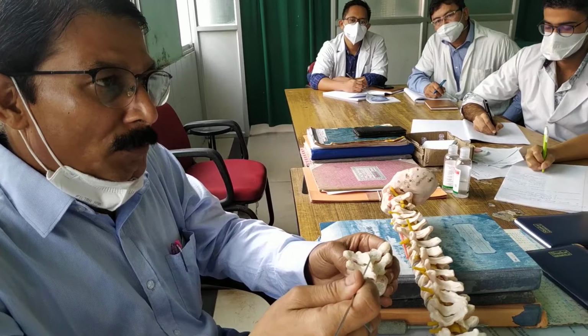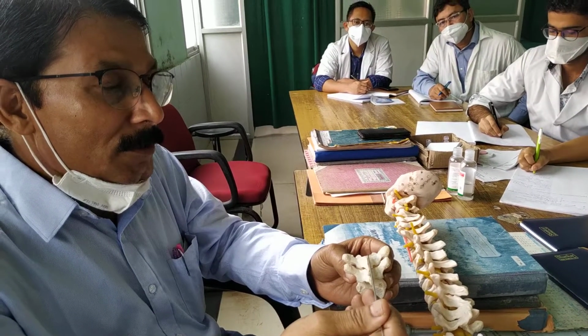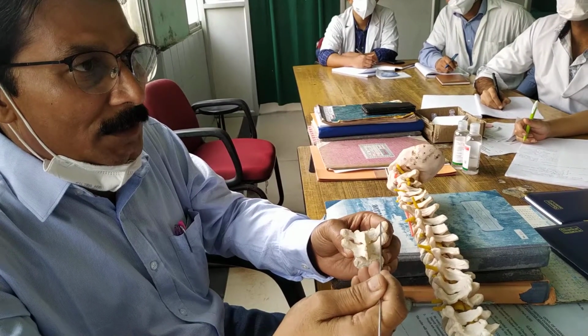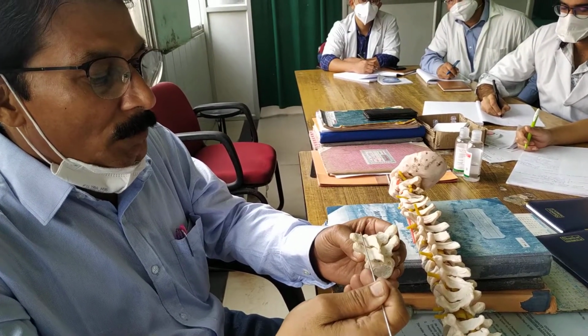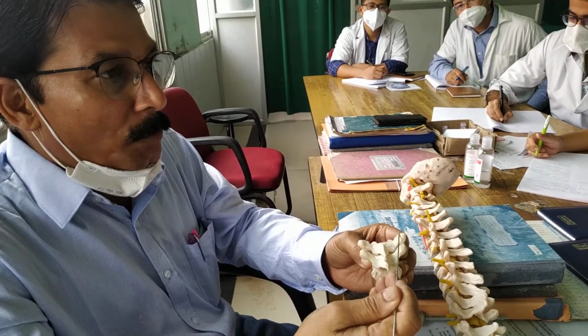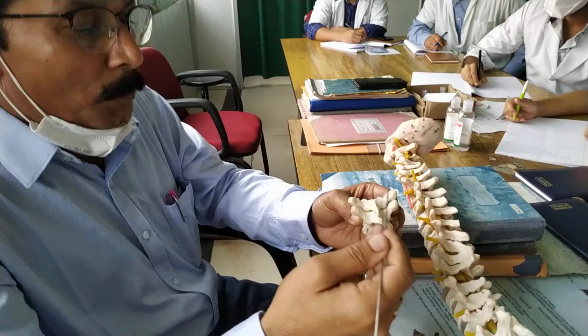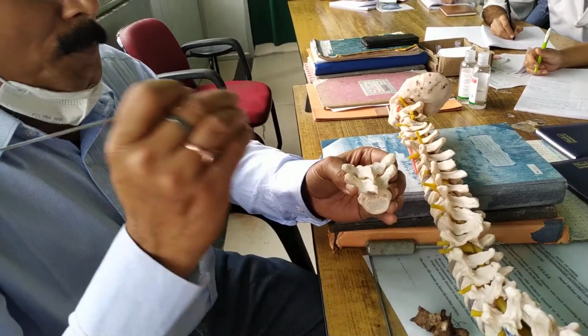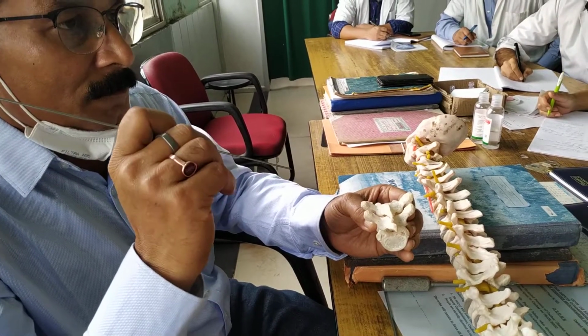Go up to the bone and do the dissection subperiosteally. Dissect towards the lateral side, both sides, and make the structures prominent, particularly the transverse process. This transverse process is very important for us.